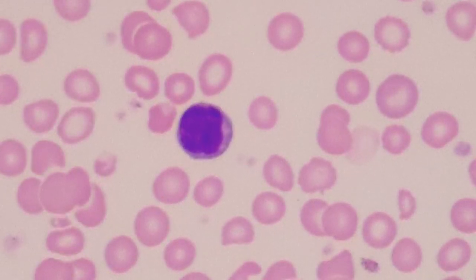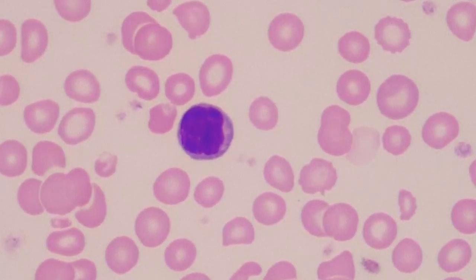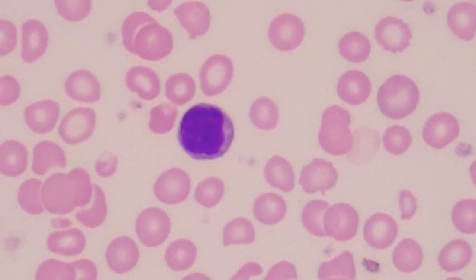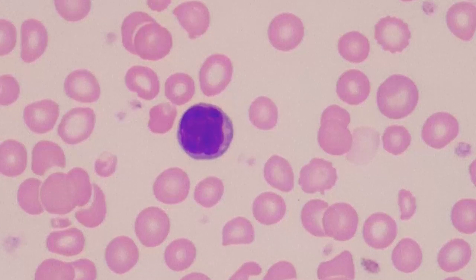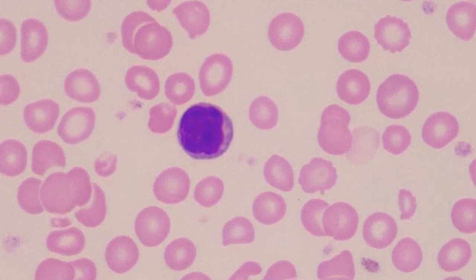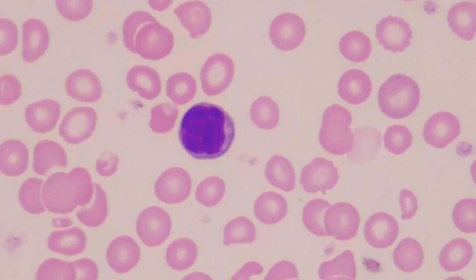And I would say that that's a good indication of what the instrument printout is telling us about microcytic red cells. It's slightly smaller than the red cell to the left. You probably could fit 2 to 3 of those smaller red cells inside that small lymphocyte. So based on what I'm seeing on the printout and what I'm seeing on the microscope, I'm pretty confident that I can say that there is probably 1 to 2 plus microcytosis on this patient.